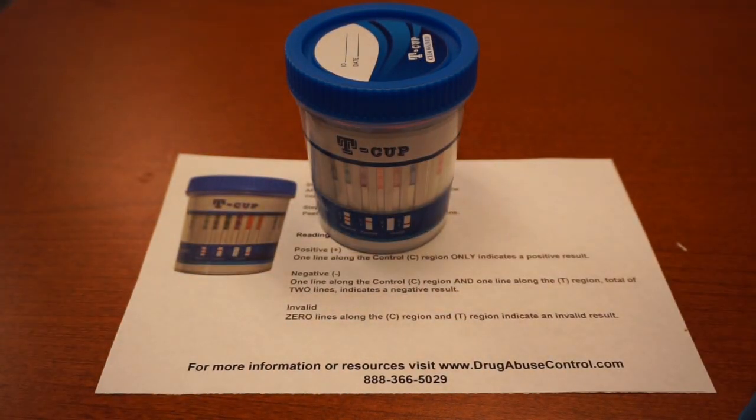This is the 14-panel drug testing kit. Have a great day. Thank you.